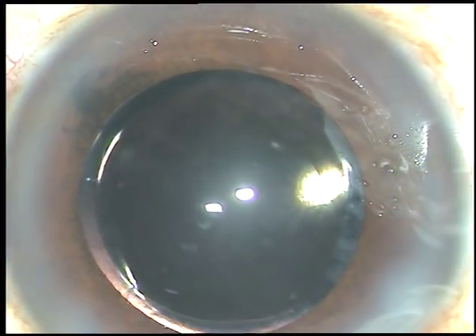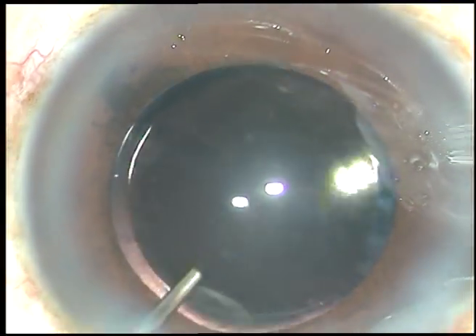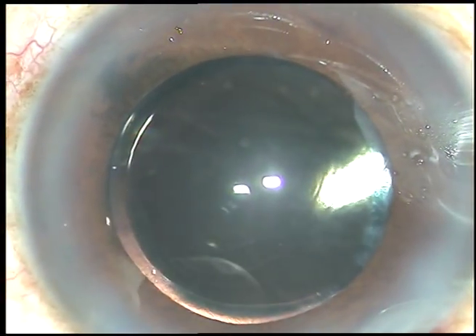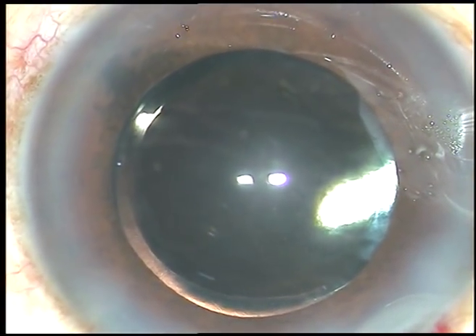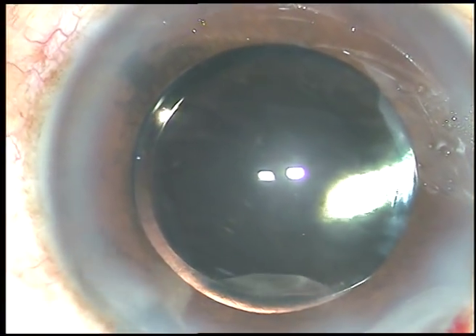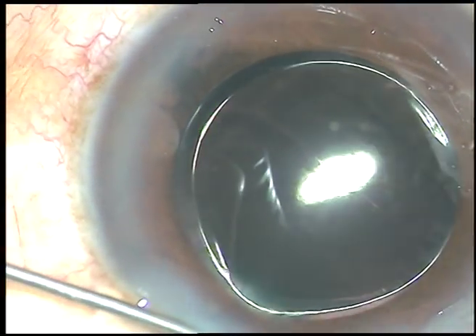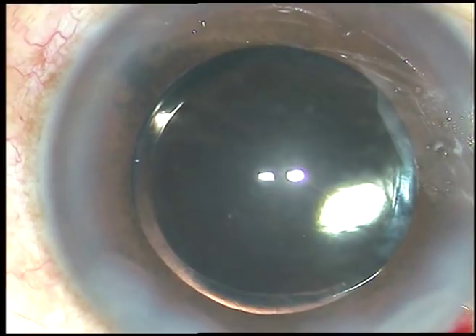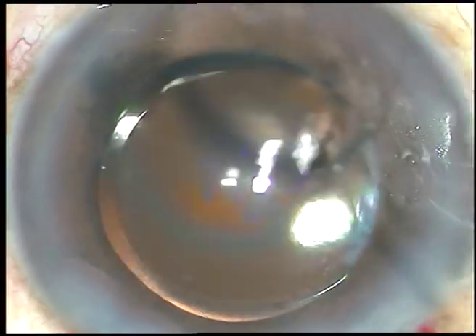And now, a little bit of moxifloxacin is injected. The single side port that has been made is hydrated to make it watertight. Final lavage of the anterior chamber is done, and the anterior chamber is formed and the case is concluded.